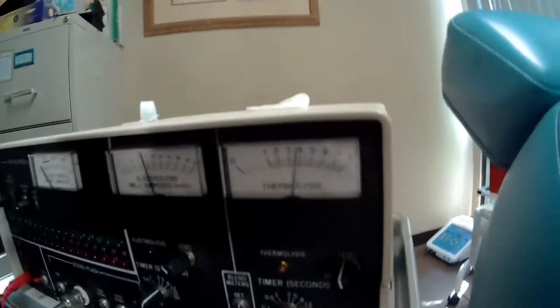Welcome back gang, just having one of my students work on my arms with this older machine — it's very educational. You've got to do a few little things different, but it's good that she's starting out with this machine because once she gets this one down, she's going to learn the rest fairly easily. So that's a good thing, and this older technology has some interesting things that I like to learn.